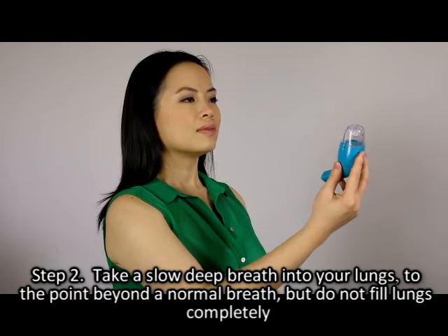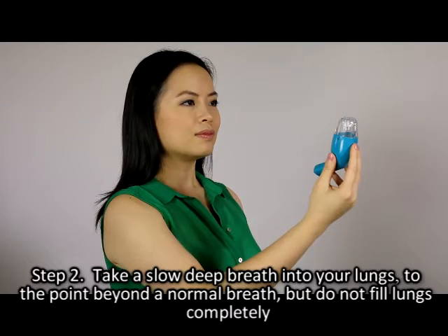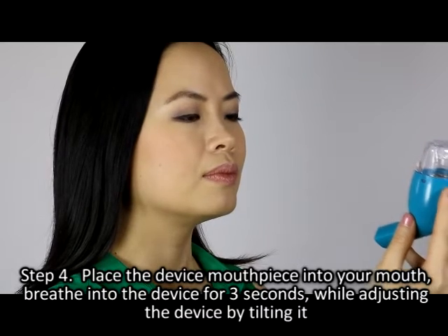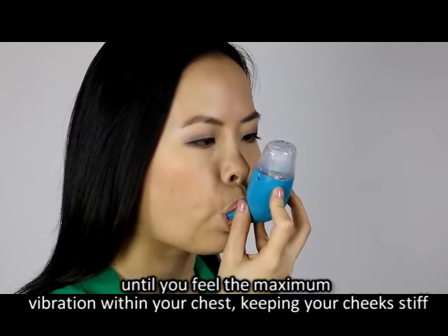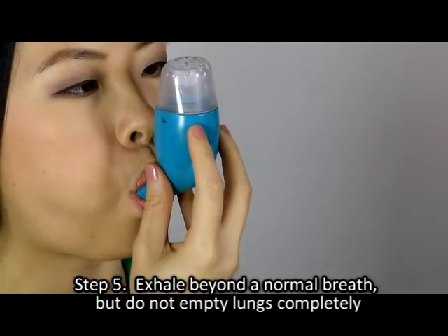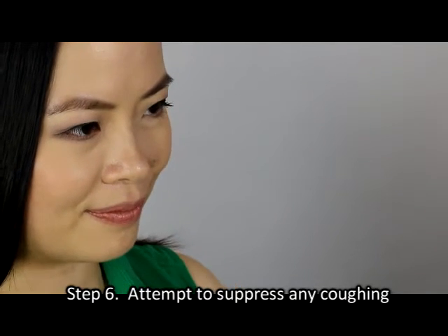Step two: take a slow deep breath into your lungs to the point beyond the normal breath, but do not fill lungs completely. Step three: hold breath for two to three seconds. Step four: place the device mouthpiece into your mouth, breathe into the device for three seconds while adjusting the device by tilting it until you feel the maximum vibration within your chest, keeping your cheeks stiff. Step five: exhale beyond a normal breath but do not empty lungs completely.